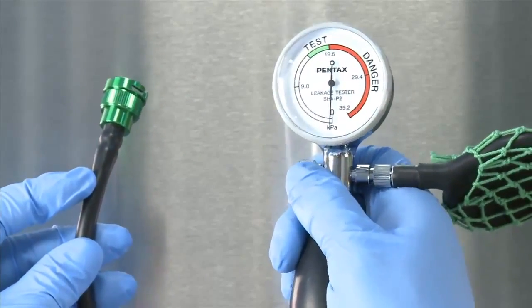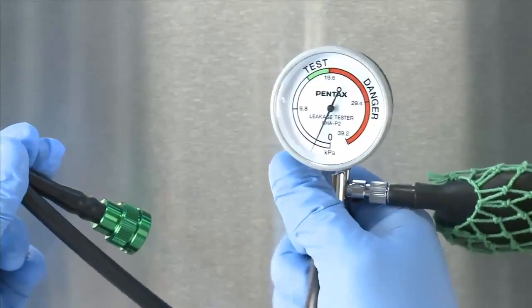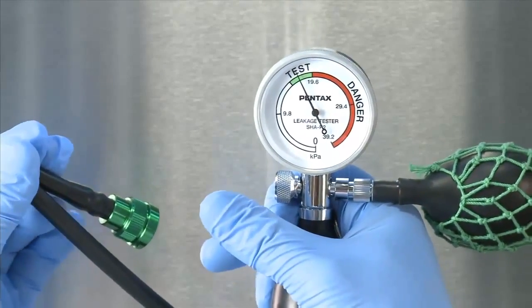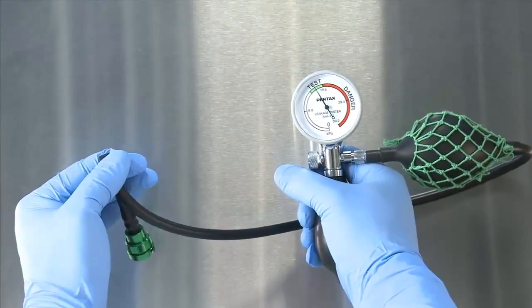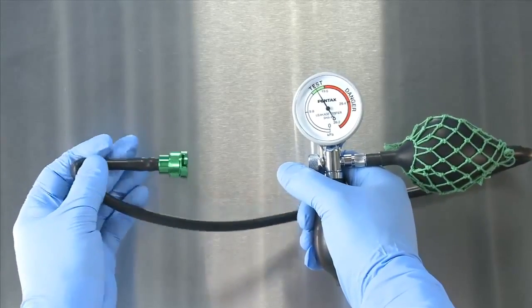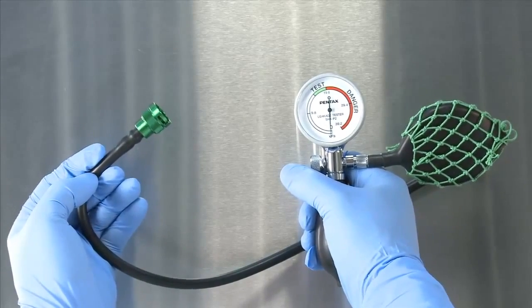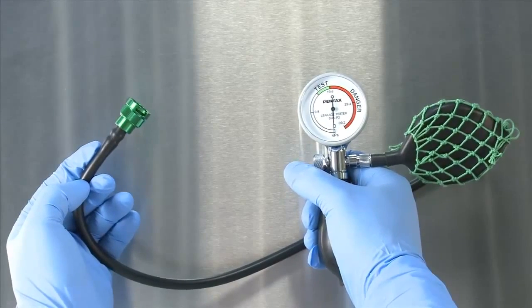Close the pressure relief valve, pinch the tubing, and pump the tester into the green zone. If the tube is fully occluded, the leak tester will hold the pressure and the needle will not move. When the tubing is released from a pinched position, the gauge needle should drop. If the needle stays in the green zone when pressure is released, the leakage tester may be damaged, and another leakage tester should be used.